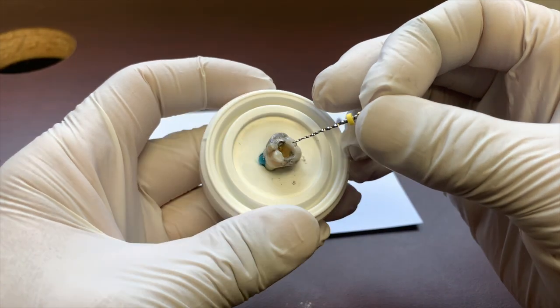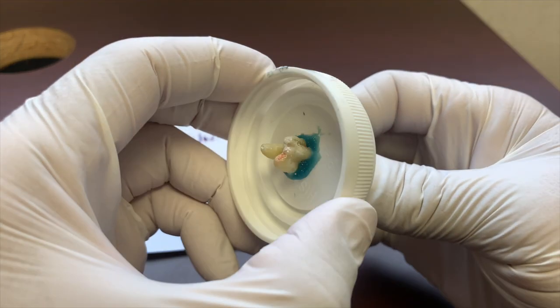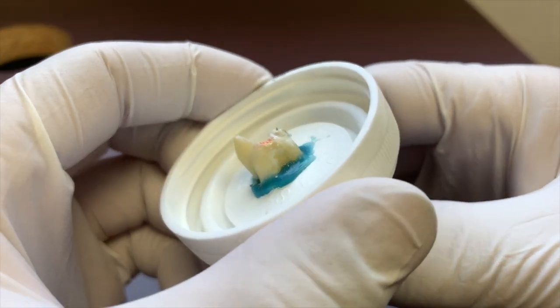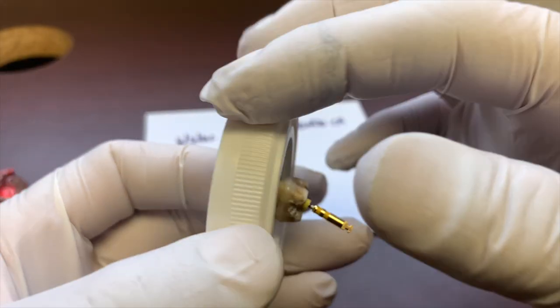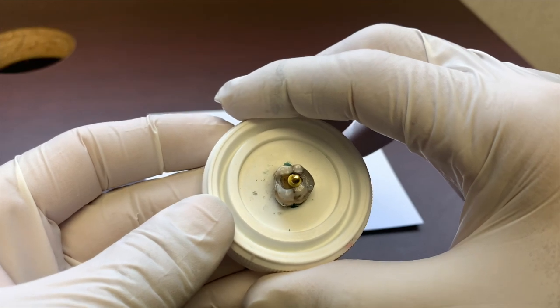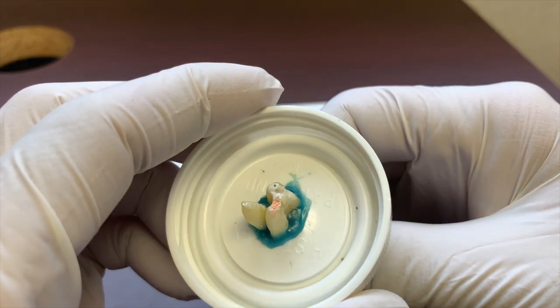So say, for example, in this case, this is a four canal mandibular molar that we root canaled. The reason it's in this is because I've mounted it in alginate, so I can use my apex locator. You're going to learn how to do that too on the course.